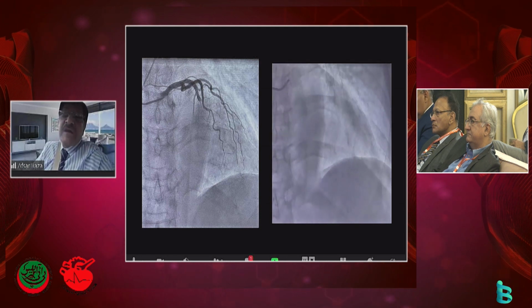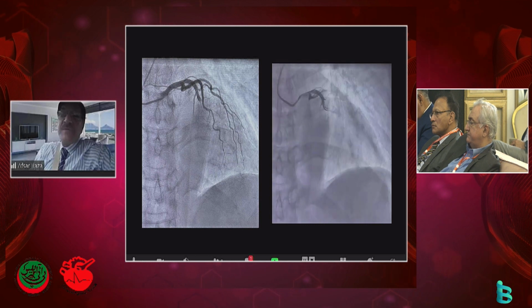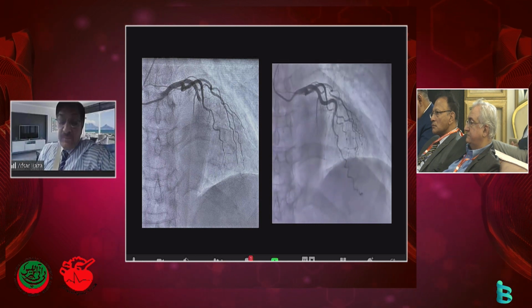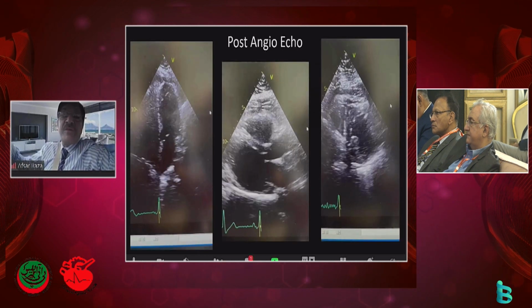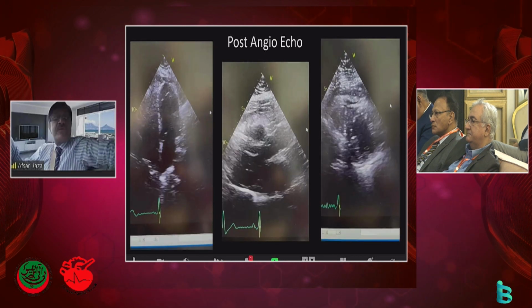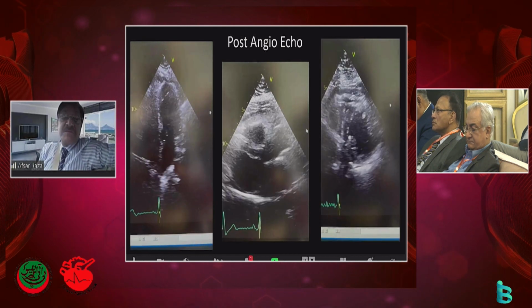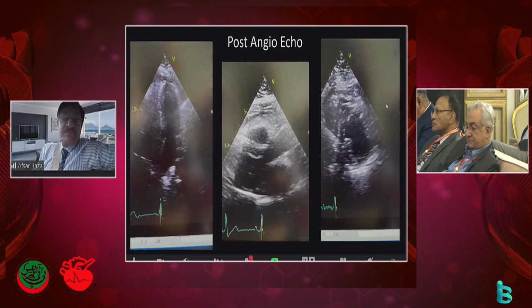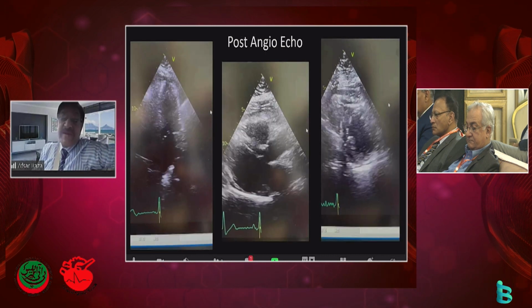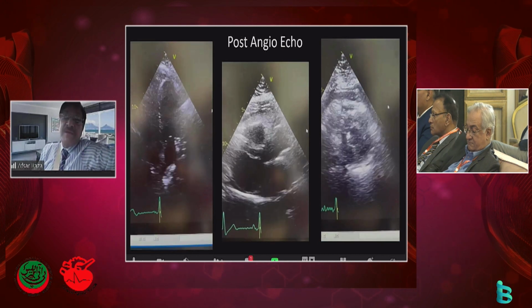It's a live case of Takasubo, where the neuroendocrine mechanism happens and there is acute spasm or thrombus, and then it washes away. But fortunately, when we did the echo, there was no Takasubo. This is the post-angio echocardiogram, which doesn't show any wall motion abnormalities. It is not clearly known, but spasm or thrombus, though thrombus doesn't wash away like this. Spasm is probably the most likely.